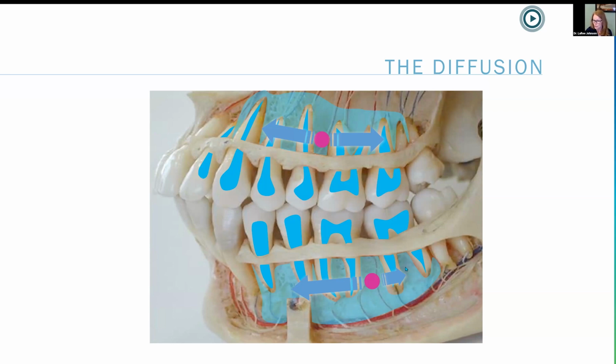But on the permanent dentition, using a 9 mil needle, I would just expect to get 1 in front, 1 behind. Now, if you look at all your data, it'll say use a 16 millimeter needle, but it's very hard to get intraosseous in a later mixed and adult dentition using that needle, because you have to be so precise directing the force along the long axis of that needle, and that makes it more challenging. So I suggest use a 9 mil for everything intraosseous. Just know when you switch to late mixed and permanent dentition, you consider it intraseptal.